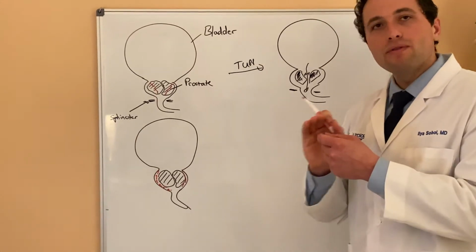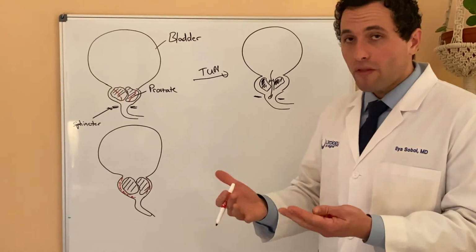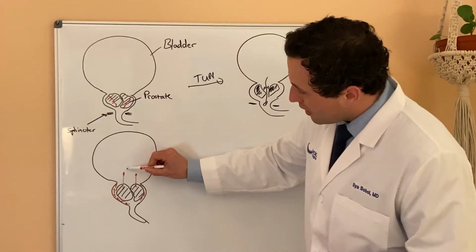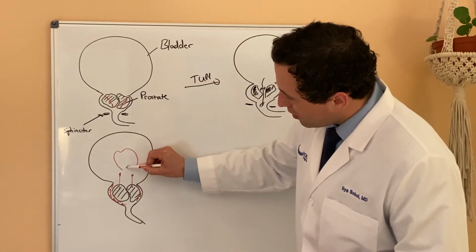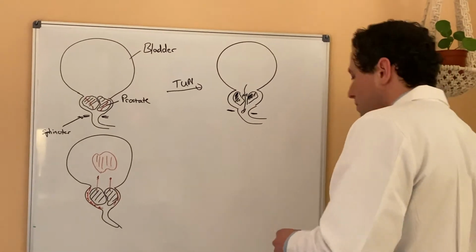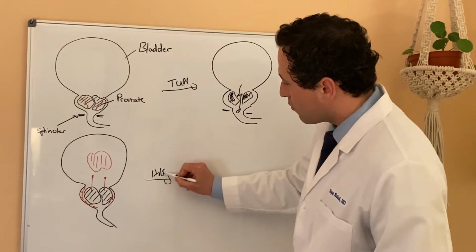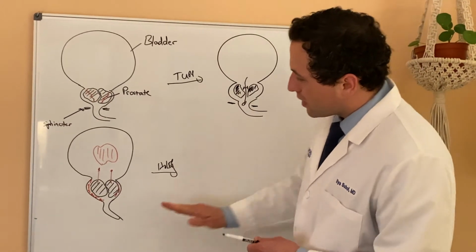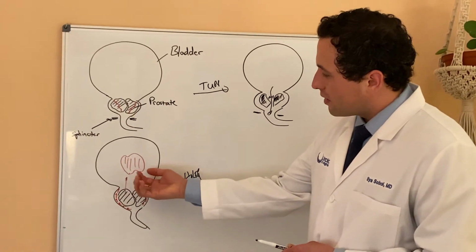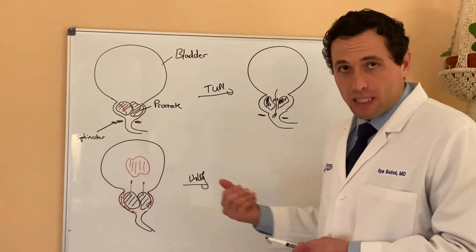all the way at the level of the rind, and you're removing all of the fruit, complete removal of all the obstructing tissue. And then that tissue is pushed into the bladder, and it's then removed. So the way it's removed is with a special device called a morcellator, and that basically goes in again through the tip of the penis. So there's no cuts on your body, and the fruit of the orange is essentially broken down and then sucked out through a special device.